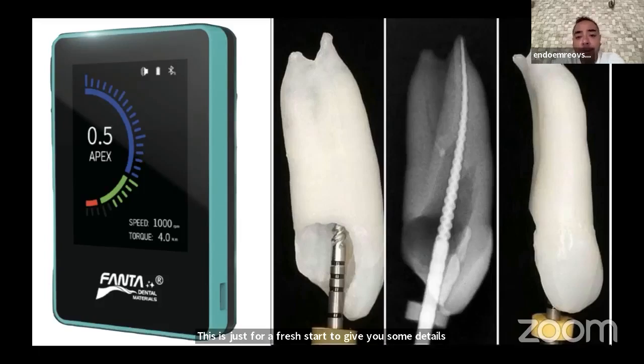So I sometimes ask in my lectures, to all clinicians, not just endodontists, for the basic stuff to get maximum performance from the apex locators: you take a radiograph, an X-ray, while you are operating on the patient, and you have a 20 millimeter working length for a tooth.